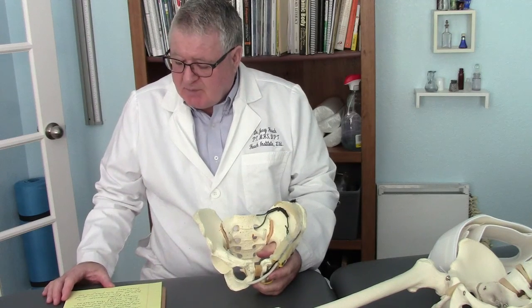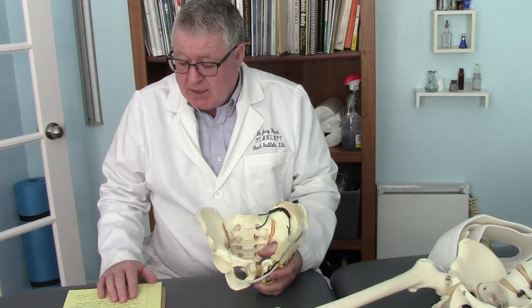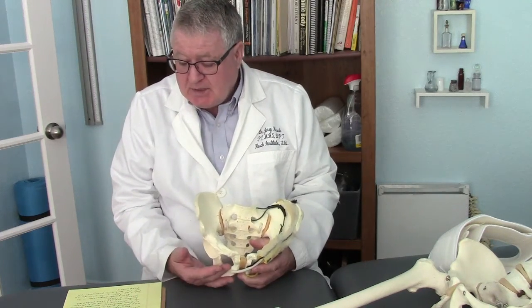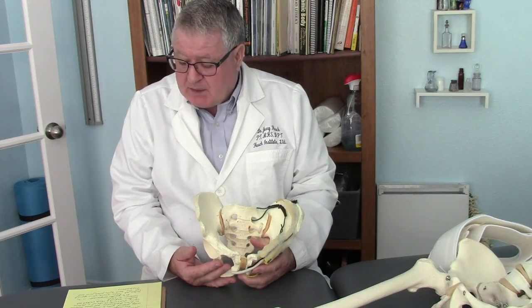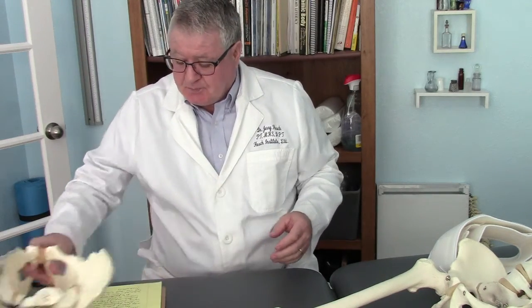Now, a key concept is that there is a minor population who may present to an outpatient clinic that has a small symphyseal diastasis or pubic dysfunction, and use of a pelvic binder can be very helpful in that population. There is some very good research that demonstrates there is 40% greater compression at both the pubic joint and at the sacroiliac joints when the support is worn down low.